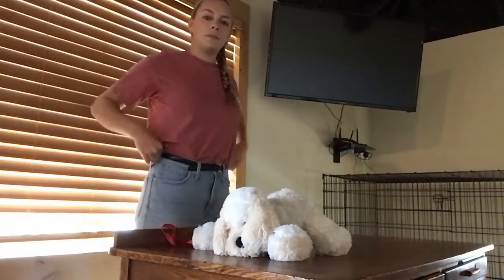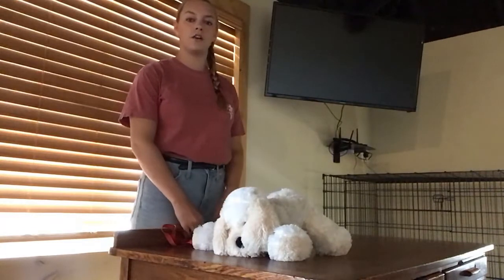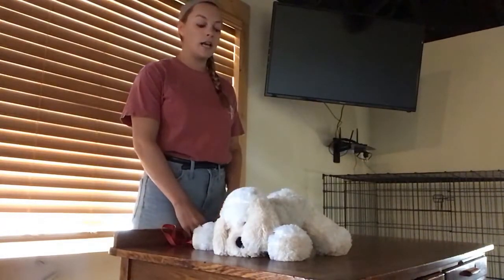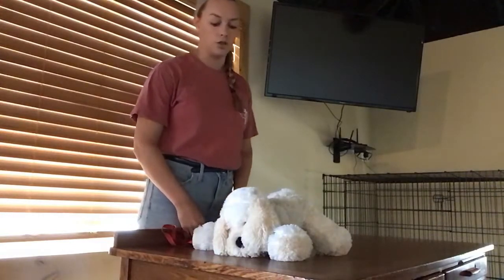Hi everybody, my name is Mason Everett. I am a second year veterinary student at the Texas A&M College of Veterinary Medicine and Biomedical Sciences. Today I'm going to show y'all how to restrain for a jugular vein blood draw.